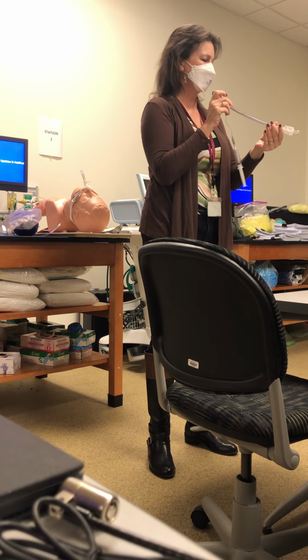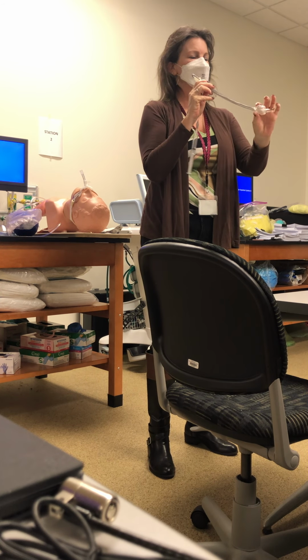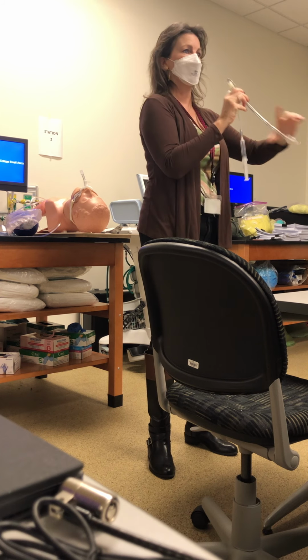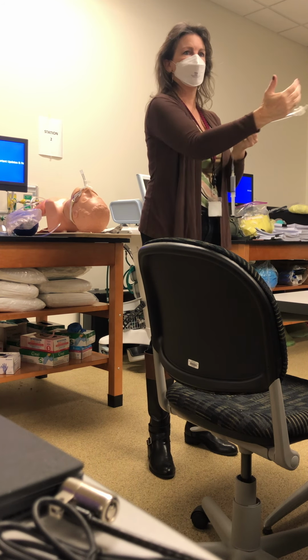Now it's more rigid. And we never touch this with our hands because this is going into the lower airway, which is a sterile environment, okay? So it's going to be in a bag, in a sleeve, right? We have our gloves on, so we're never going to touch the bottom part of this.